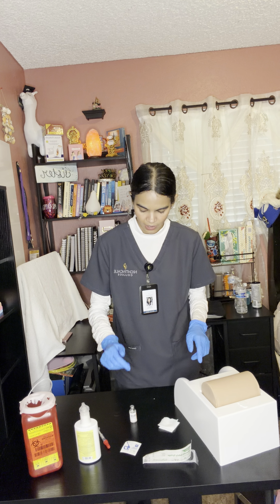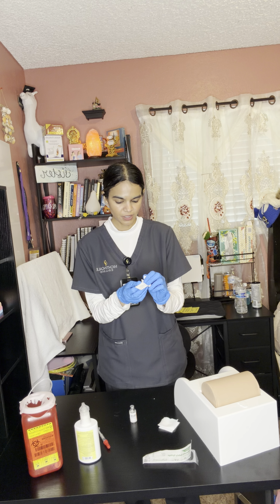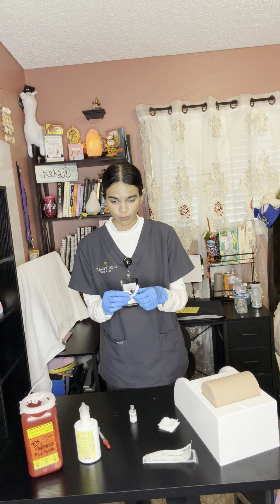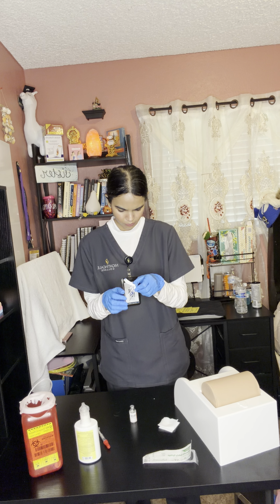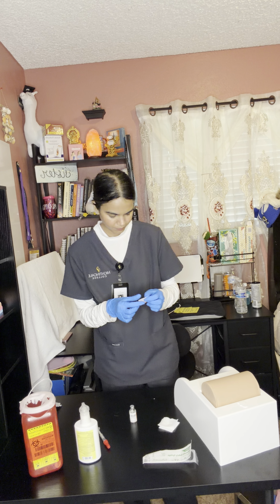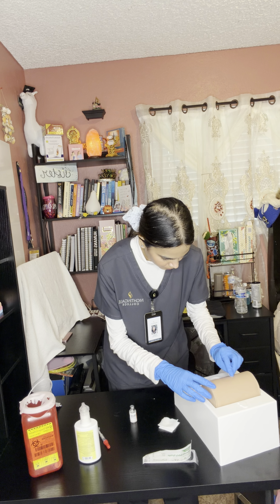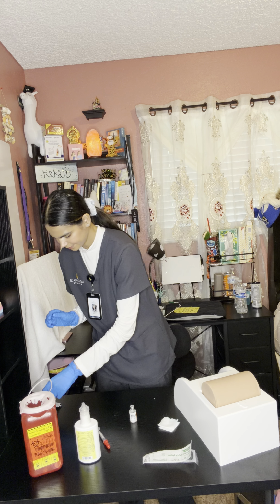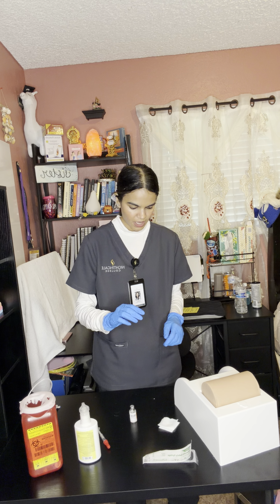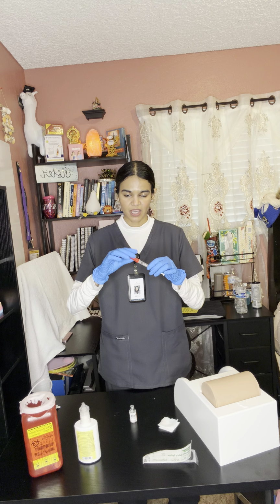I will then clean the area with the alcohol pad. We'll start from the center and move out 2 inches to the outer. We'll rub in circular motion. Alright. Then, with my non-dominant hand, I will pinch the skin, but before doing that, I will grab the medication with my dominant hand and uncap it.